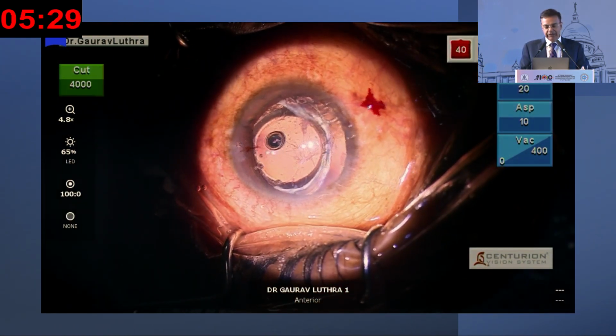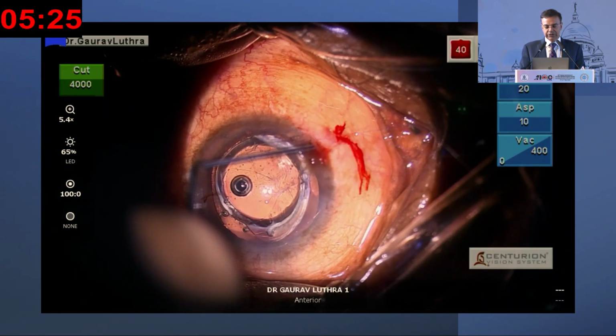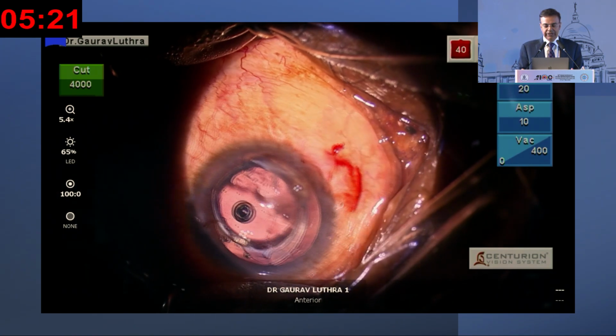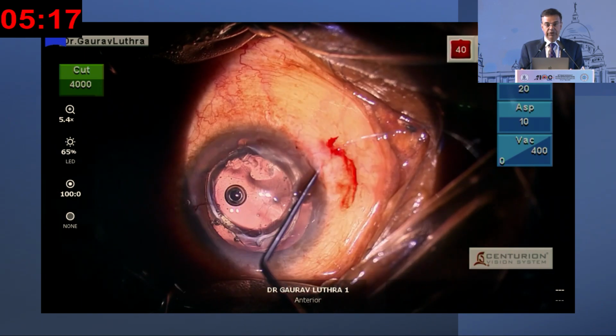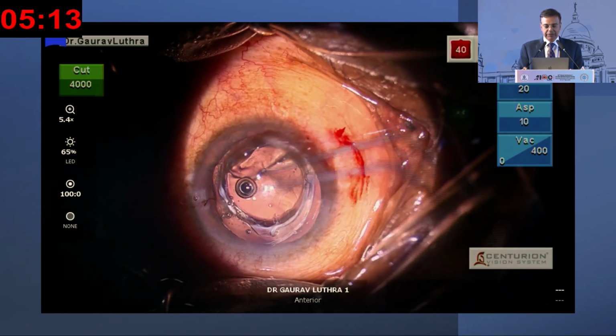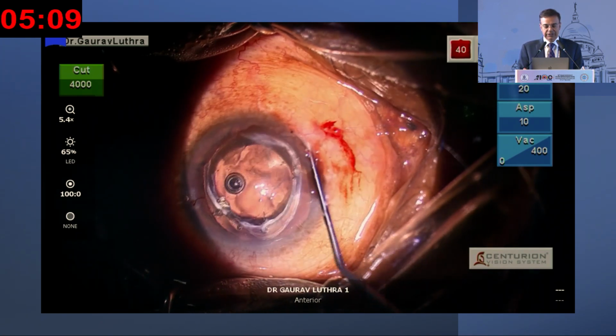And one has to be very careful when making these pockets that they are of the correct dimensions, because if your suture is passed too posterior and not passing through the pocket, you will have a problem finding the suture later on, and then you can be in soup. So you have to know the landmarks and you have to mark out till what depth you have passed the Hoffman's pocket. Otherwise, there's a good chance that you will go wrong.